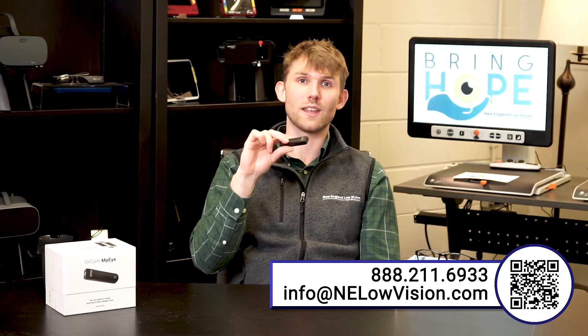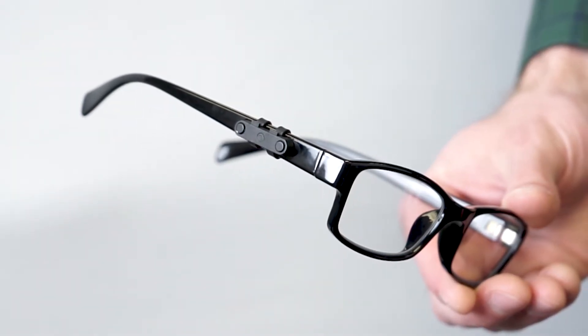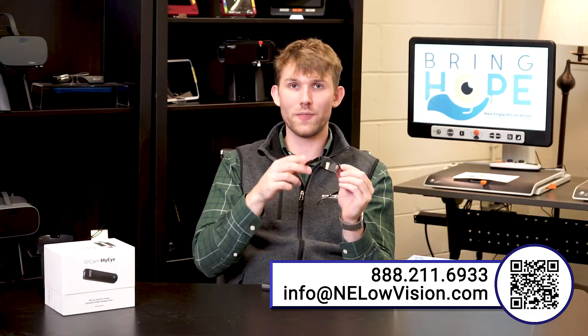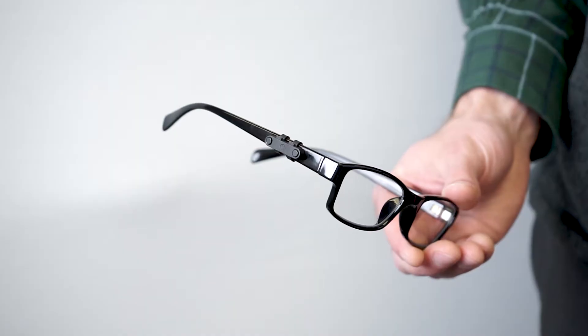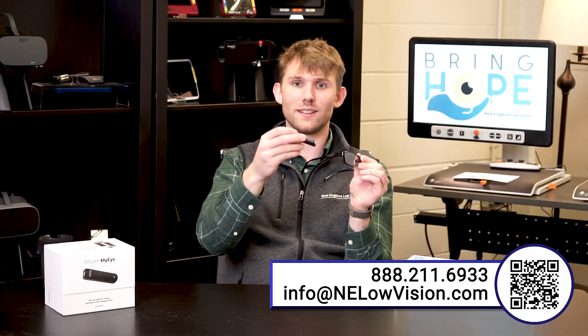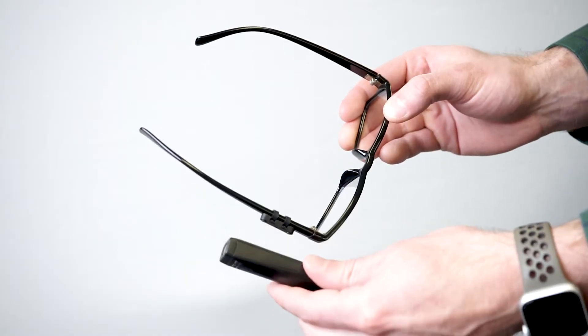You can actually attach this to any frame that you have. It comes with magnetic attachments so you can easily connect the MyEye onto any glasses frame you own. One thing to note is that it can only be attached one way — if you accidentally do it the wrong way so the camera is facing behind you, the magnet will repel it. This is a great design feature for people with low vision.